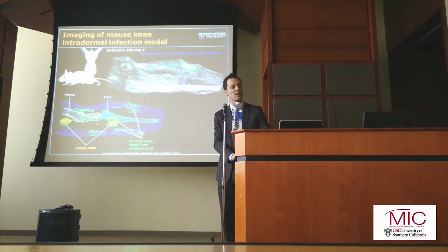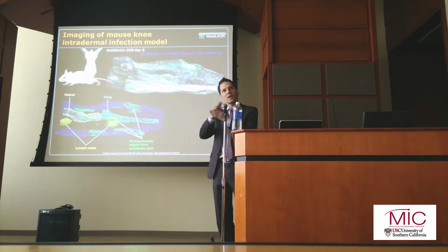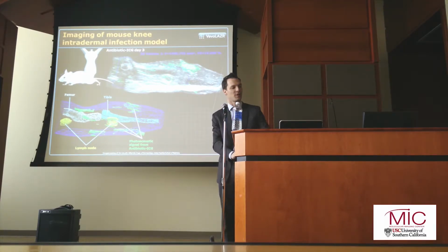And the infection was inoculated intradermally, so they just injected it under the skin, and you can actually see, on the surface, these lesions in the skin caused by the infection. And of course, we see a lot of the dye accumulating right there at the site of infection. But unlike the optical modality, we were able to see deeper in the tissue. Now you can see a whole bunch of different places where we see that dye accumulating. Potentially a whole bunch of different places where you've got that infection spreading.